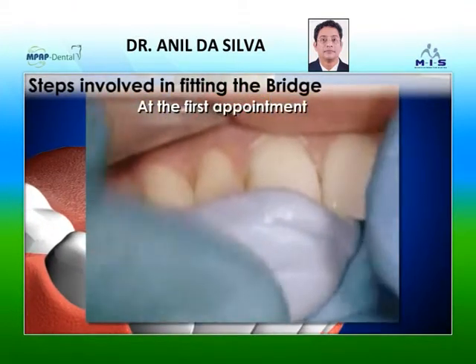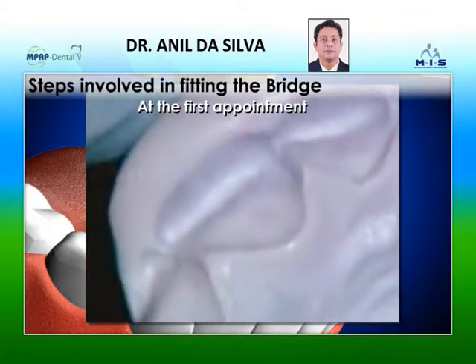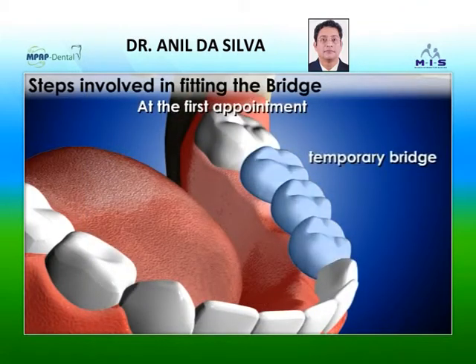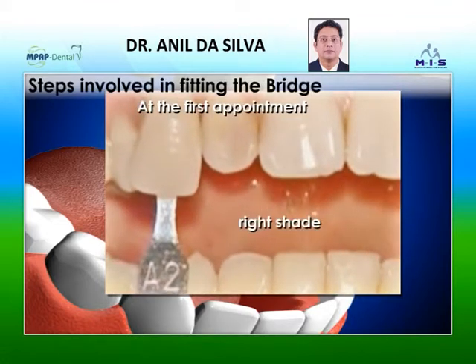The dentist then uses dental putty to make an impression of the teeth, which will be used to make the bridge and crown in the laboratory. A temporary bridge is fitted to protect the exposed gums and teeth. A shade guide may be used to determine the right shade for the dental bridge.